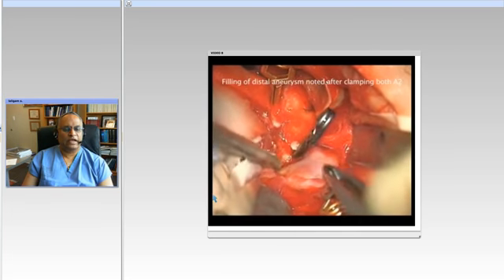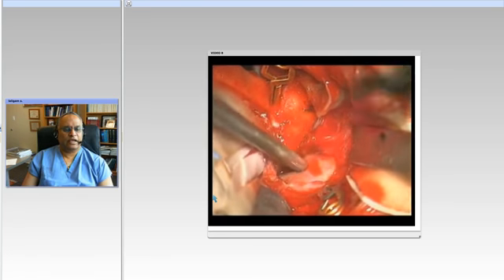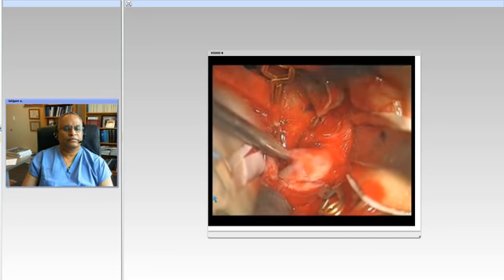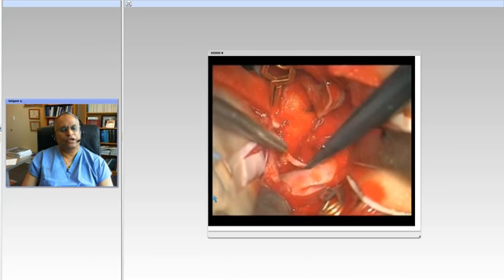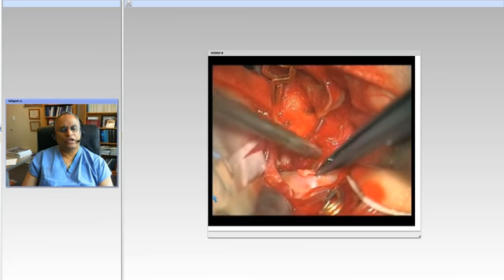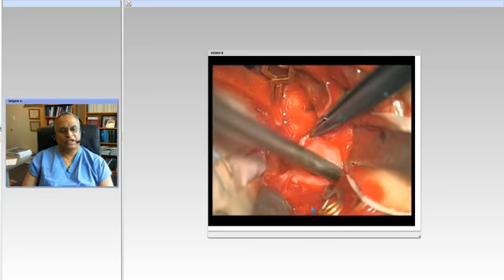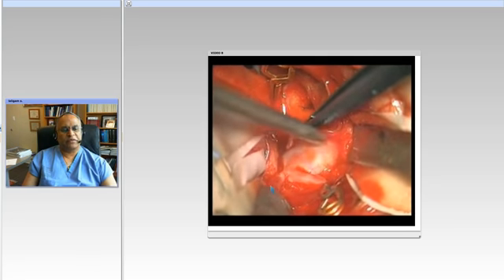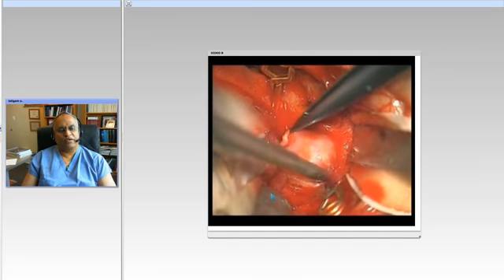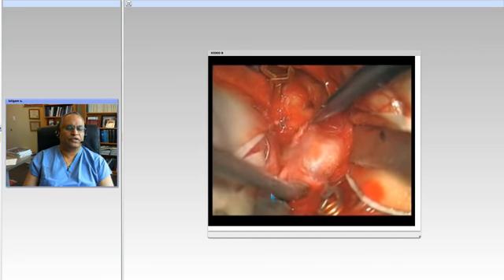So once that's done, I could dissect the aneurysm. The aneurysm is completely occluded, so we can get this out. And we have to have a good look around. You may ask me a question, what happened to the lenticular striates? I found the lenticular striates were arising really from the M2 segment. So whatever might have come out of the aneurysm presumably was clotted and never gave any problems to the patient.